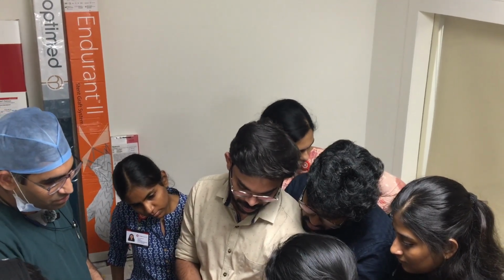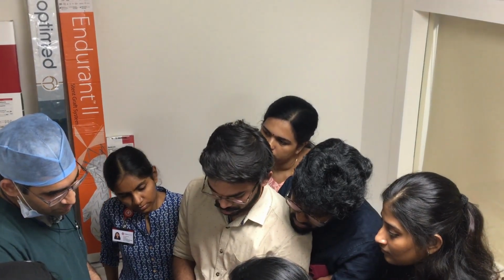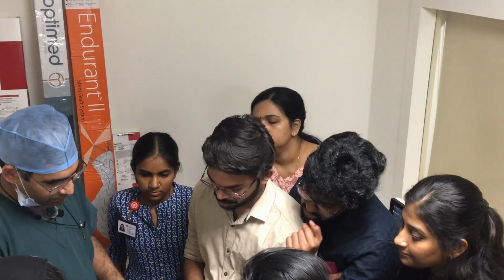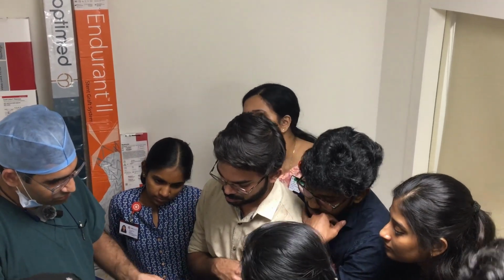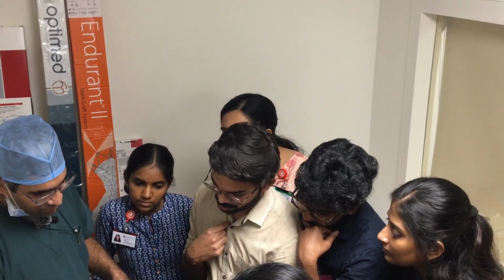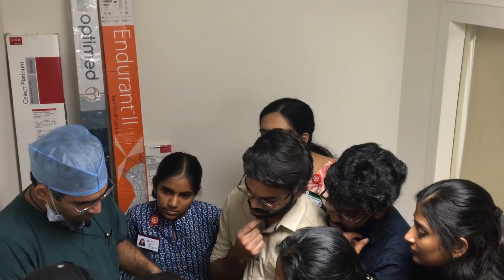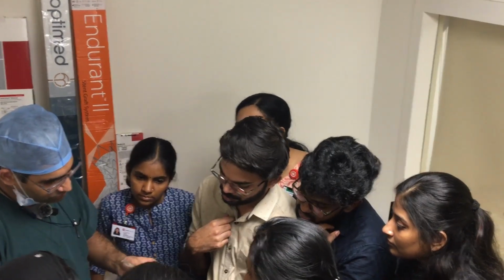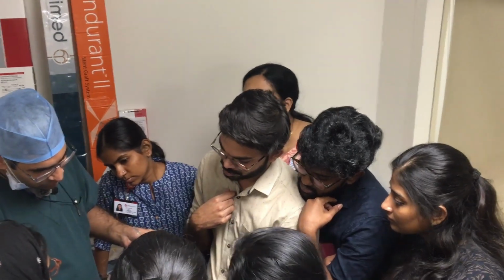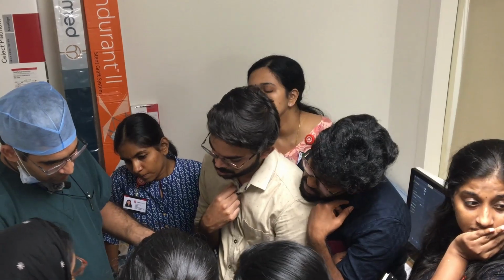Most of the shaft is okay, but in between the balloon zone, so its configuration is, if you see it, the balloon part will be soft. You see it is very flexible. The wire will come out from somewhere here. Okay. Which wires? Any 0.014 wire. So the wire goes through here. From the side it comes out. There will be a hole in the side where it will come out. Here the wire will come out.